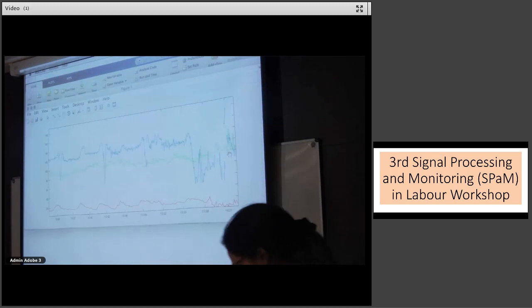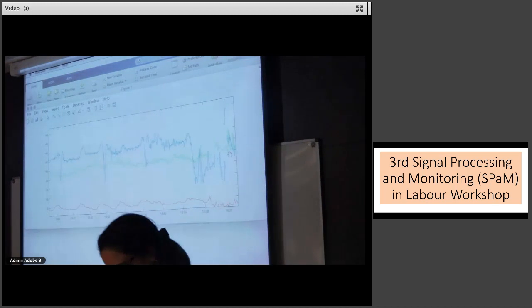We set up oxytocin and then we count the contraction frequency, as though oxytocin's influence is only in increasing the contraction. Yes, but actually the amplitude of those contractions and the duration are equally important. Oxytocin toxicity is not especially measured by the frequency of contraction.